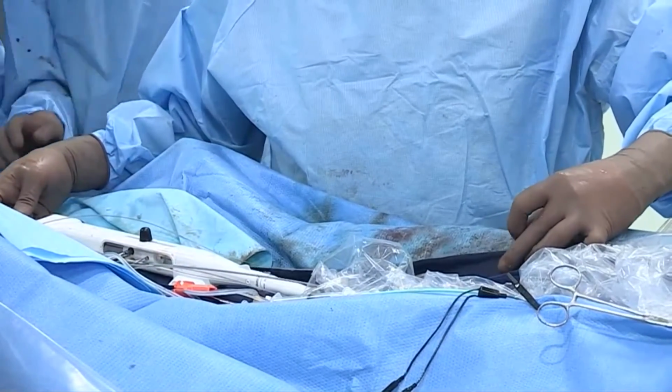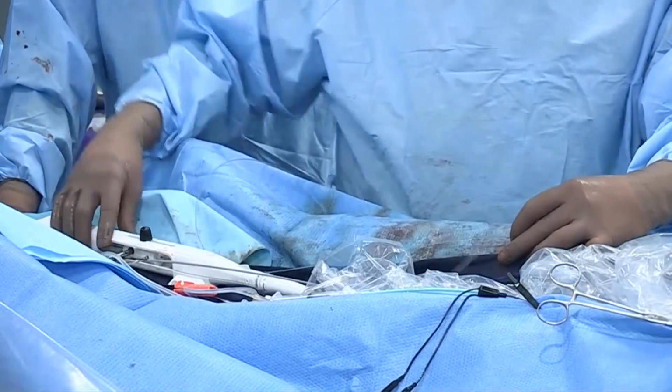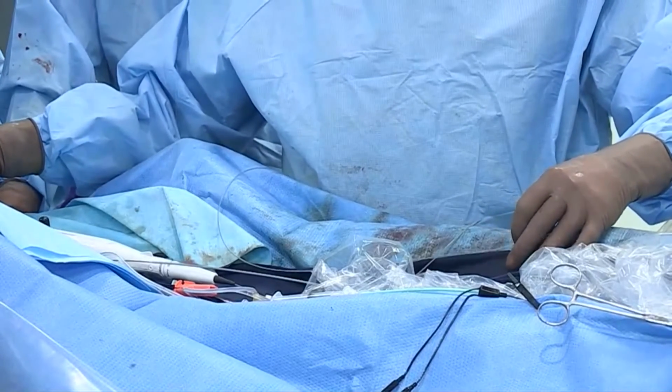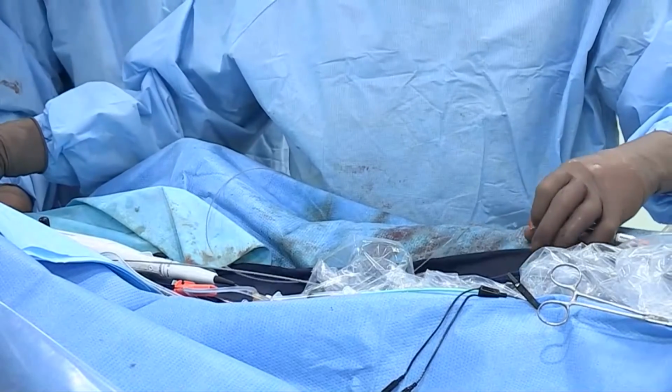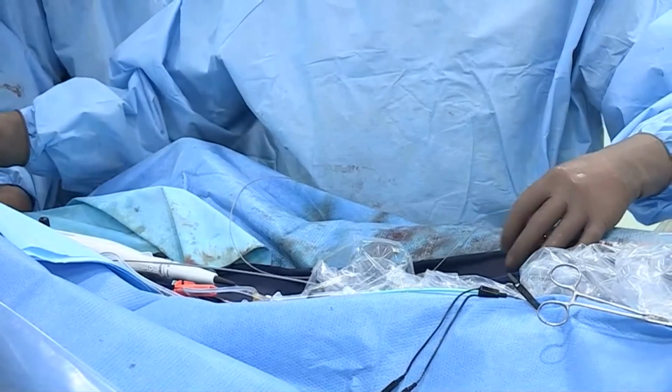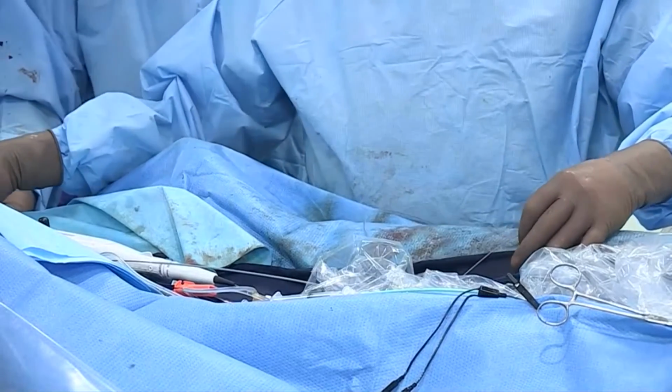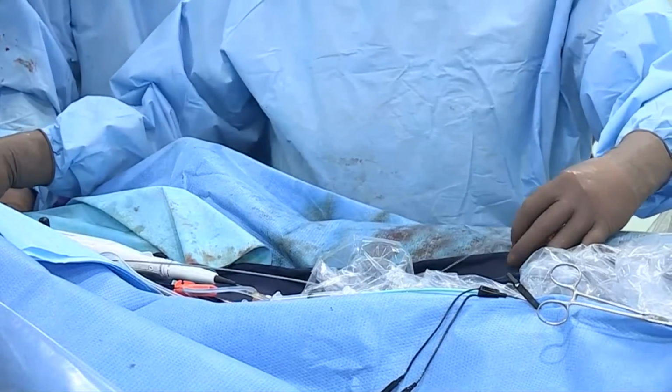There's some people who do this step on Dynaglide. We do the same in our center in Germany. So we go ahead until the aortic arch, and then probably if you have some resistance, then we go with Dyna. But we go ahead without until we feel some resistance.